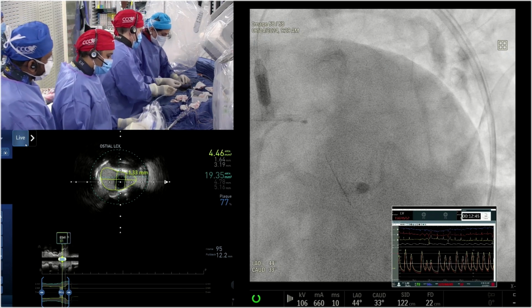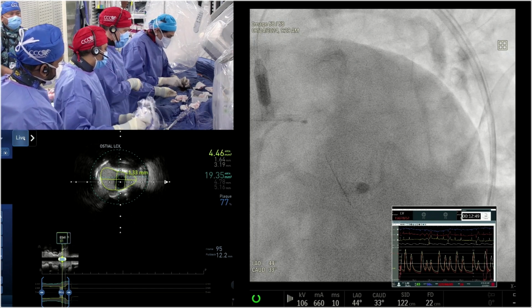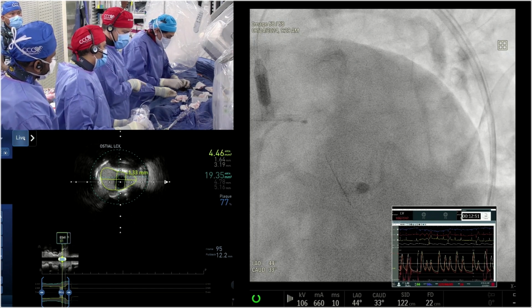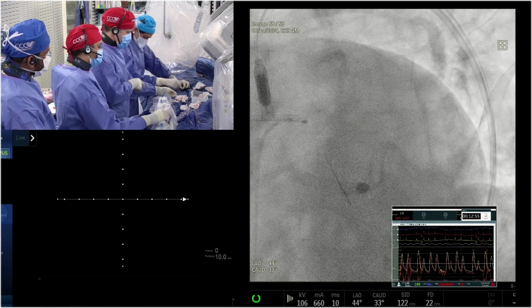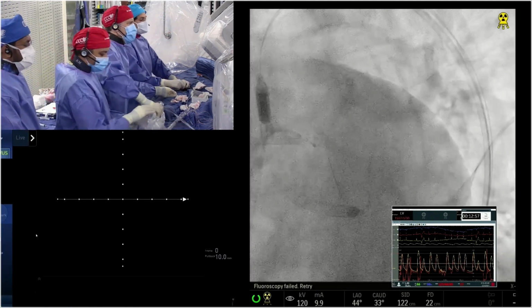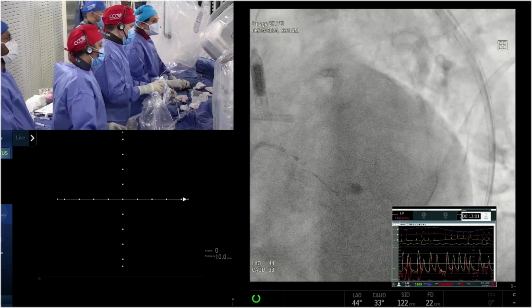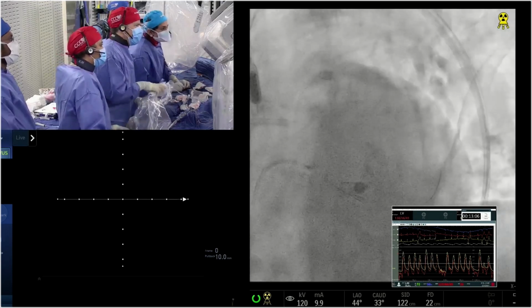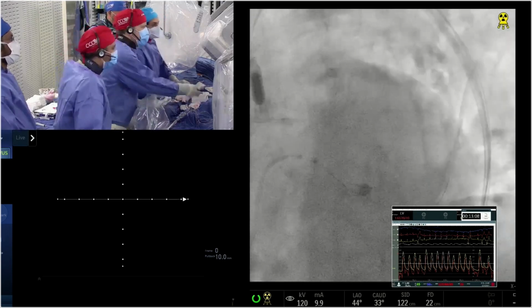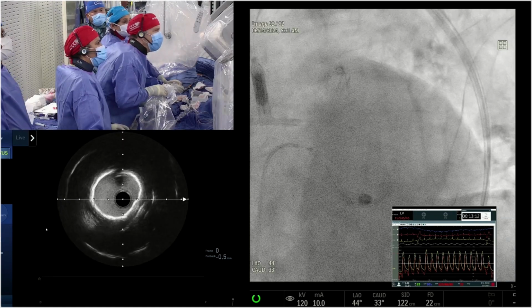I completely agree. Imaging is critical when you're planning IVL. Sometimes what you see is that you're in between, like if you have a 3.75 or 3.25, do I do a 3 or do I do a 4? You should always size up, because you're only going up to 4 atmospheres generally, so you're not worried about dissection that way. Okay, now we are going live with IVUS.